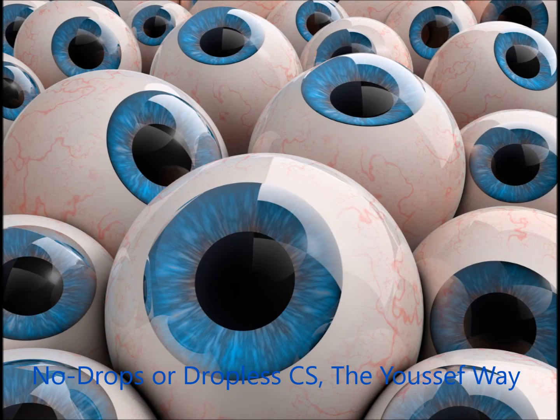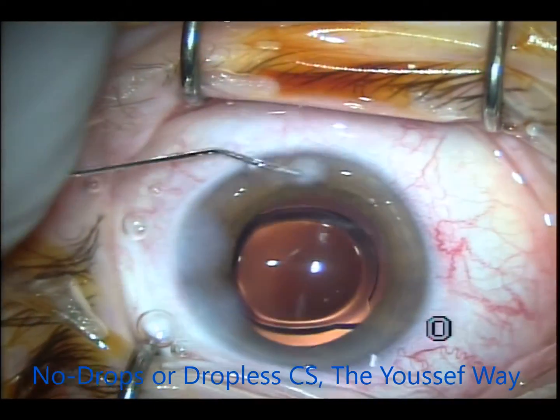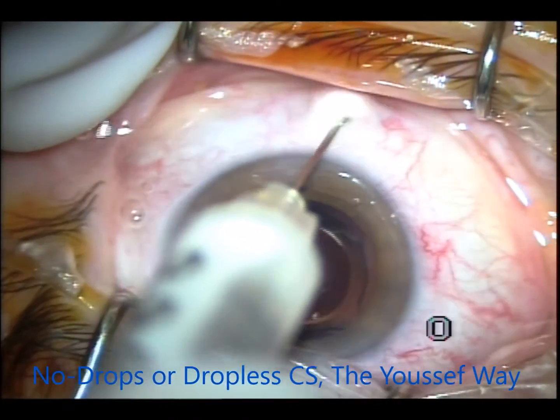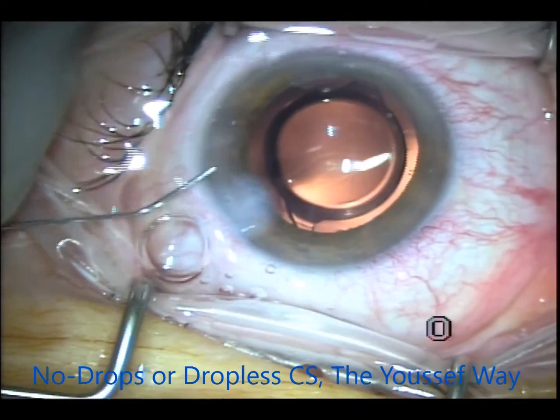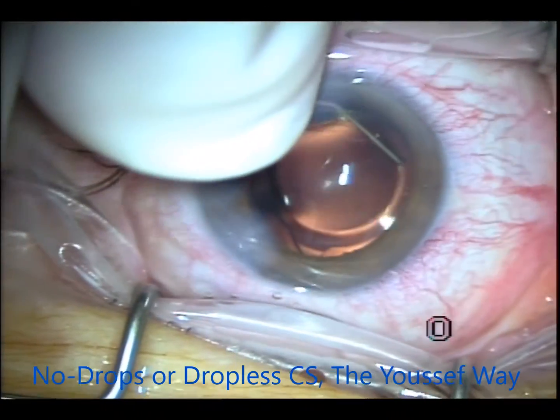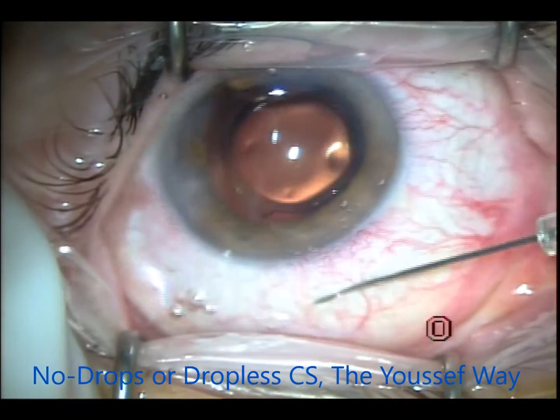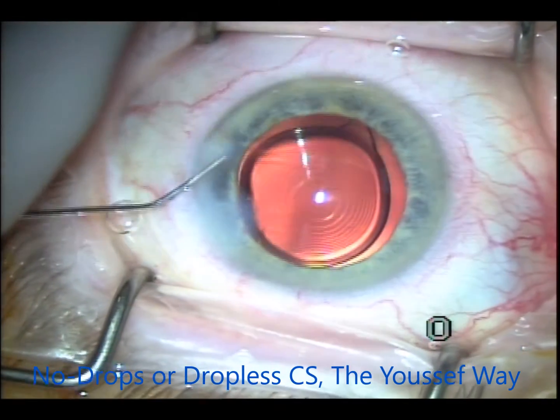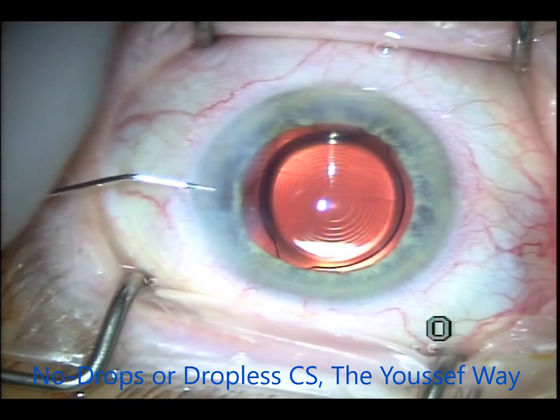The results are very similar to using drops or the transzonular intravitreal route. I'll show a few more cases, sped up for the sake of time, just to show that this has been done quite a few times. The moxifloxacin part I've been using since 2004. The subconjunctival route for Tri-Moxie I've been using for a few months now, and it's working very well. It's very convenient for patients who can't put in drops.